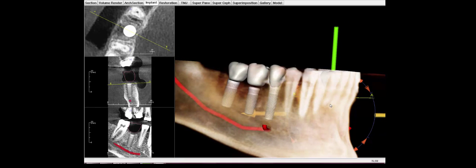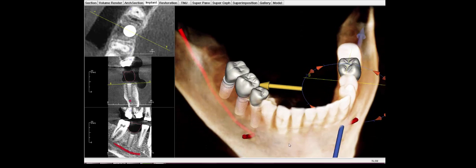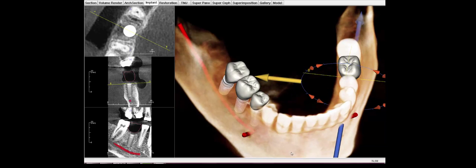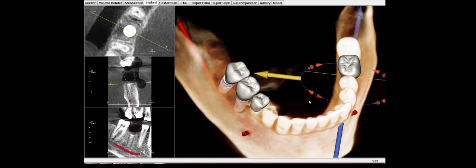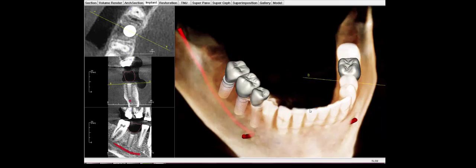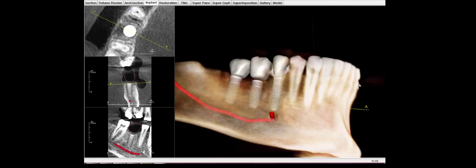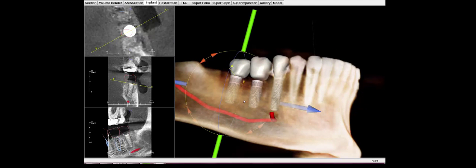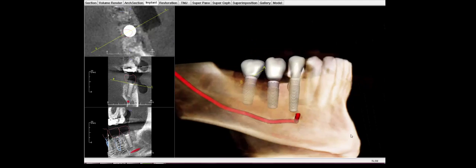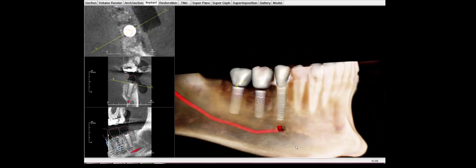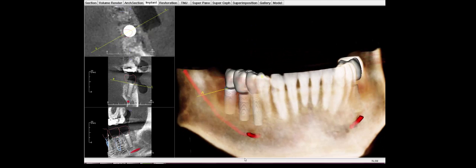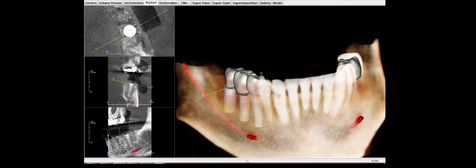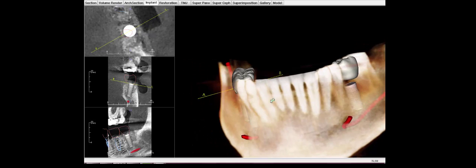I removed the teeth and I also grafted bone into the sockets using the patient's own blood, using a product we call PRF that was made from his blood with a combination of cow bone and human bone was implanted into these sockets at the same time of extraction. Those are difficult extractions. I removed the wisdom teeth simultaneously. But again, we have excellent quality of bone and quantity of bone. There's enough of it. It's dense enough.